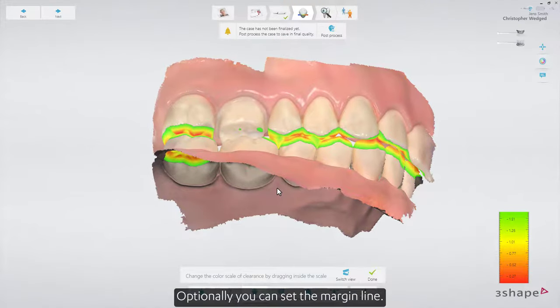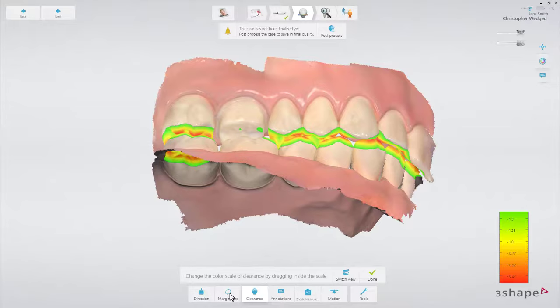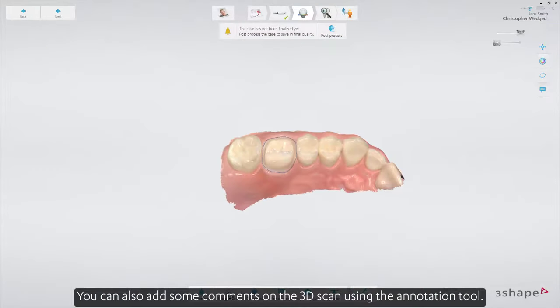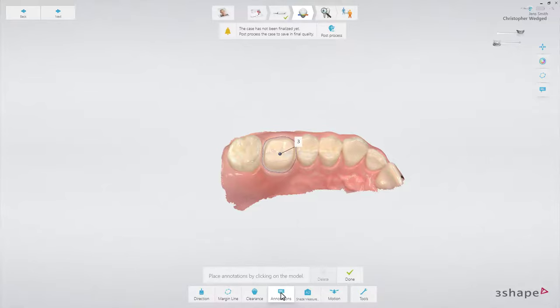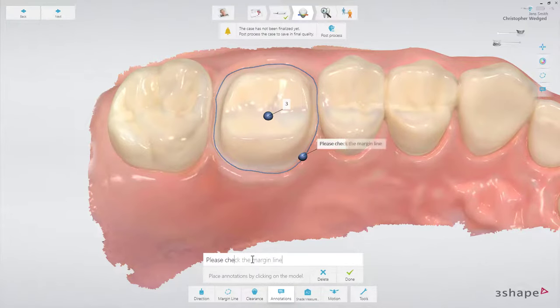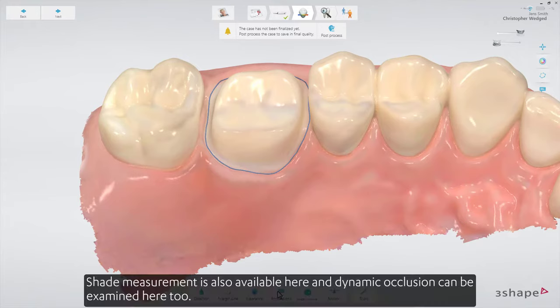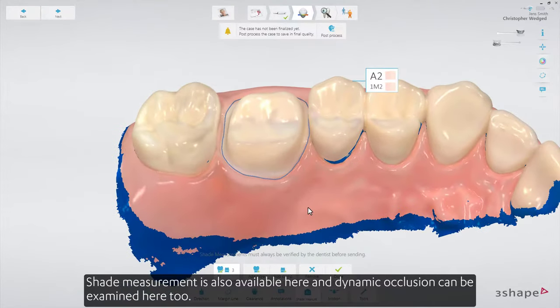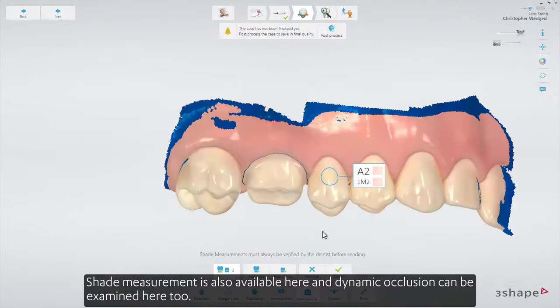Optionally, you can set the margin line. You can also add some comments on the 3D scan using the annotation tool. Shade measurement is also available here, and dynamic occlusion can be examined here too.